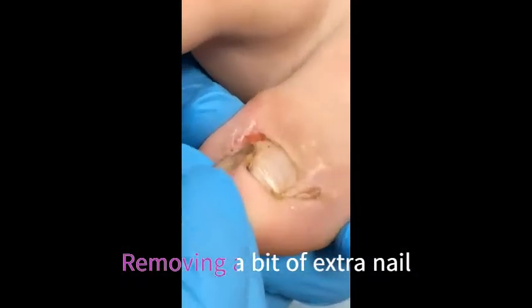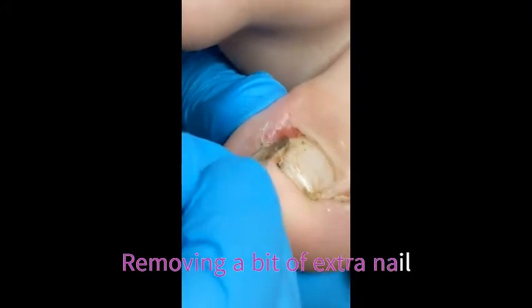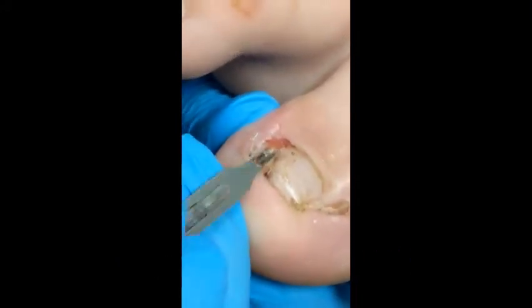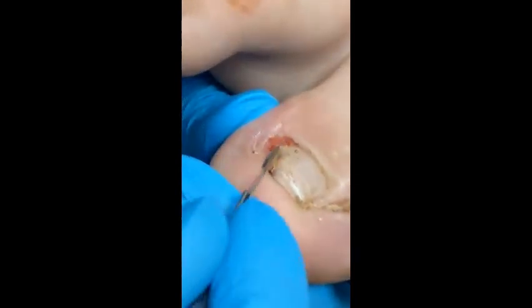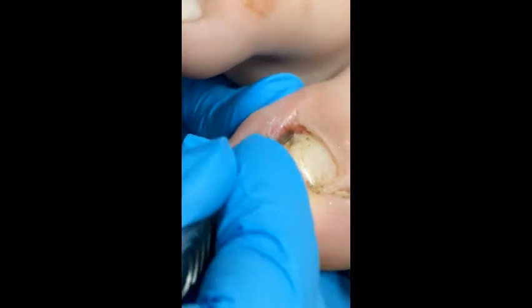It looks like scar tissue. This is the edge of the nail, this is the end bit. You can see maybe a little bit of nail — I'm going to go down and wiggle, wiggle, wiggle.